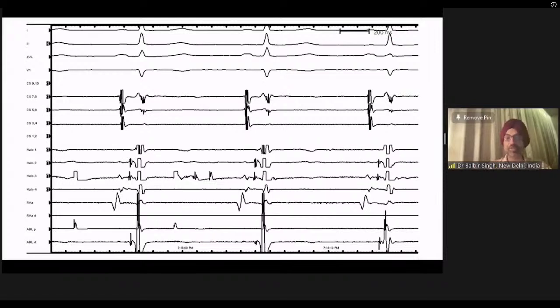So when we have such a patient, it is very mandatory that you map the whole right bundle and the His bundle properly. It is not a quadripolar which will serve the purpose. You can see in this patient, we have a decapolar introduced into the His bundle system. We start with the top tracing, which is the distal right bundle. We come down to the proximal His bundle. So this part of the tracing has to be mandatory if you want to give a differential diagnosis to this kind of a tachycardia. You would see in the sinus rhythm, there is no evidence of pre-excitation.